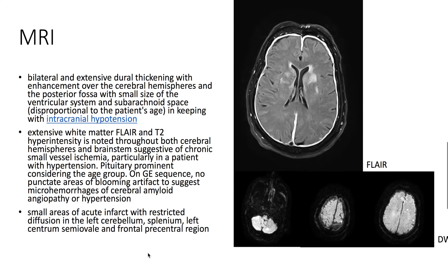Here on MRI, we see that there's bilateral extensive dural thickening with enhancement over the cerebral hemispheres and posterior fossa.